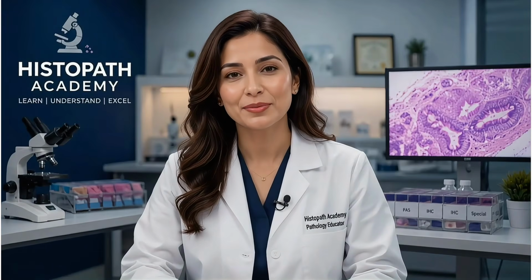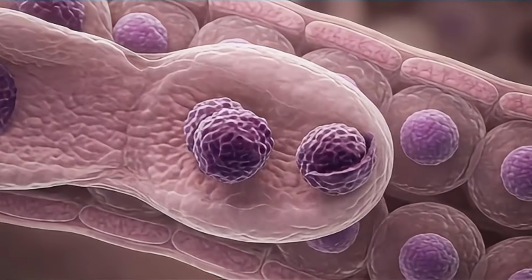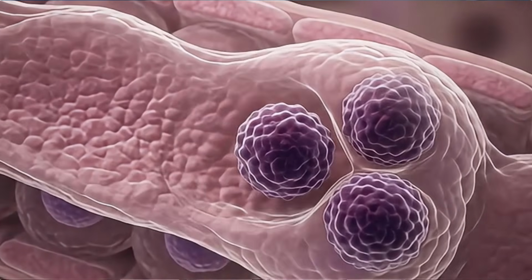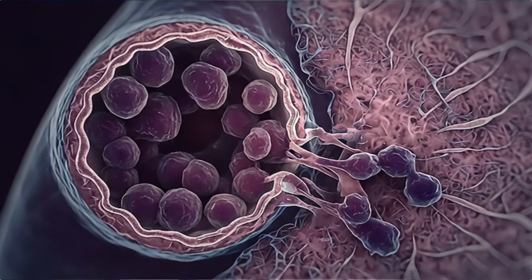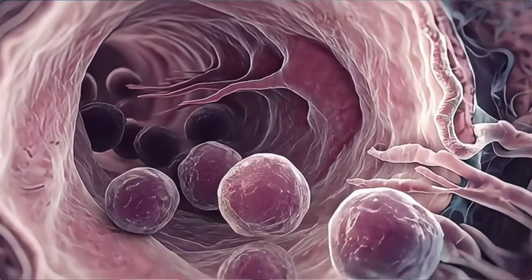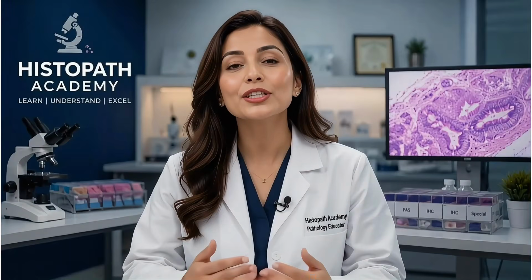But cancer doesn't appear overnight. It begins when some of these cells stop following the normal rules. They multiply uncontrollably, lose their orderly arrangement, and gradually become abnormal. At first, these abnormal cells remain inside the duct, but once they break through the wall of the duct and enter the surrounding breast tissue, the diagnosis changes. That is the moment pathologists use the word invasive, and that's exactly what we're about to see under the microscope.